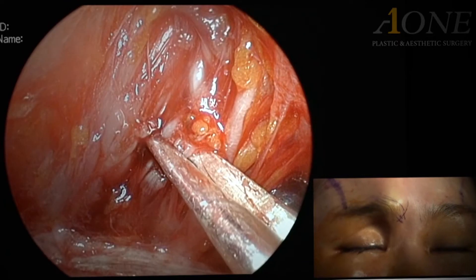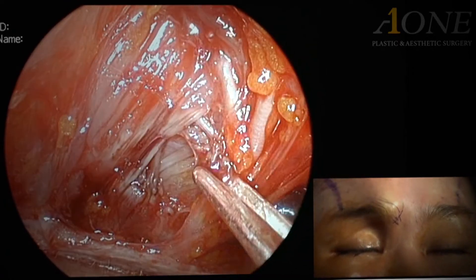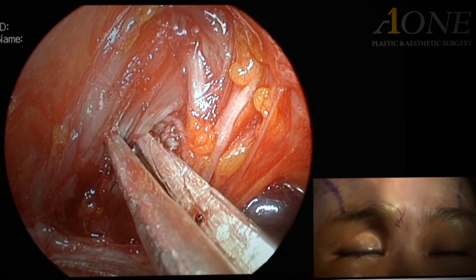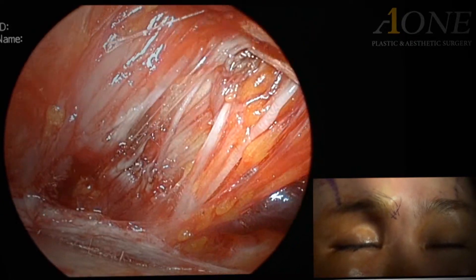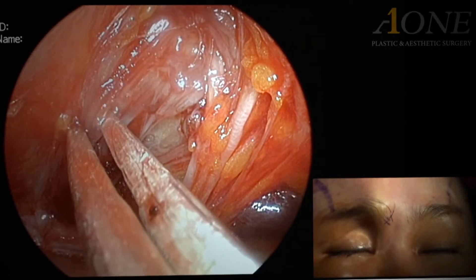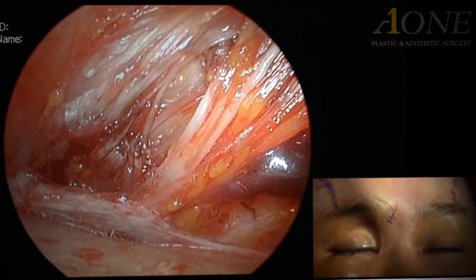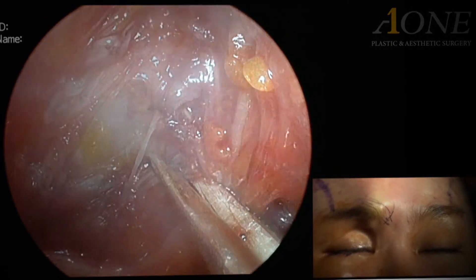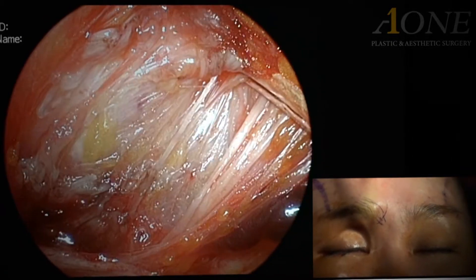By using an electric cautery to cut the muscle, an endoscopic view of the surgery can be clearly secured. As this area's muscle is cut, the process of cutting the corrugator superciliae is finished.